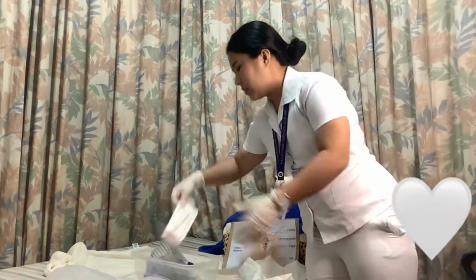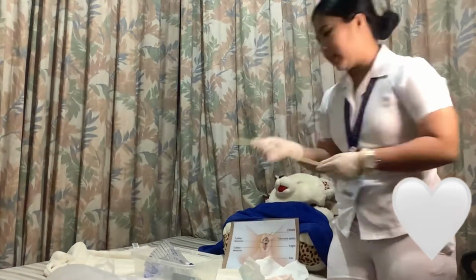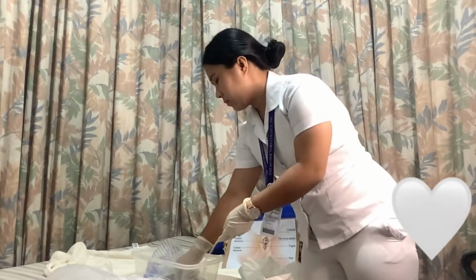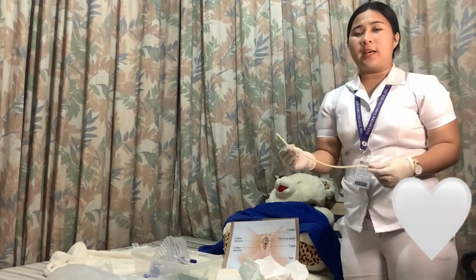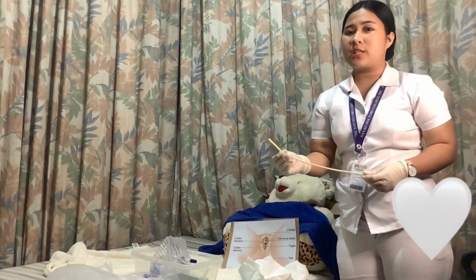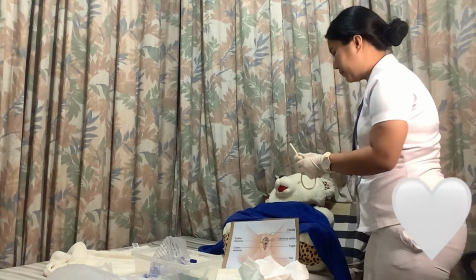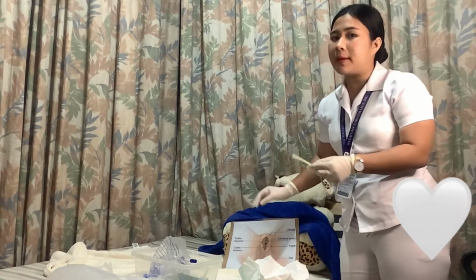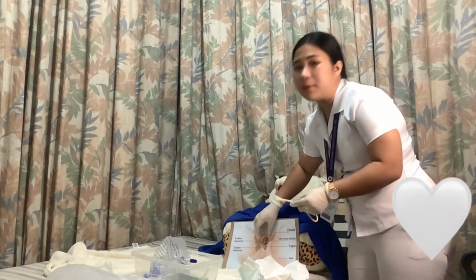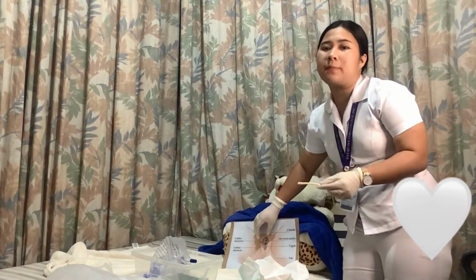Next is to lubricate the catheter for about 1.5 inches, being careful not to plug the eye of the catheter. So, pick up the catheter at least 3 inches from the tip and place the thumb and one finger of the left hand between the labia minora. Separate and pull up gently.